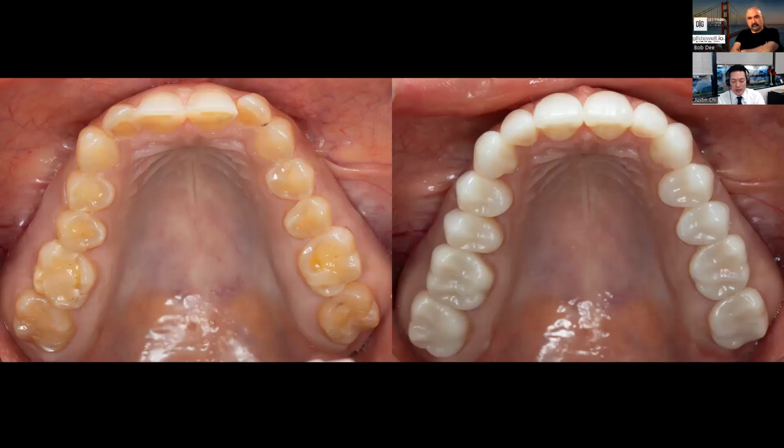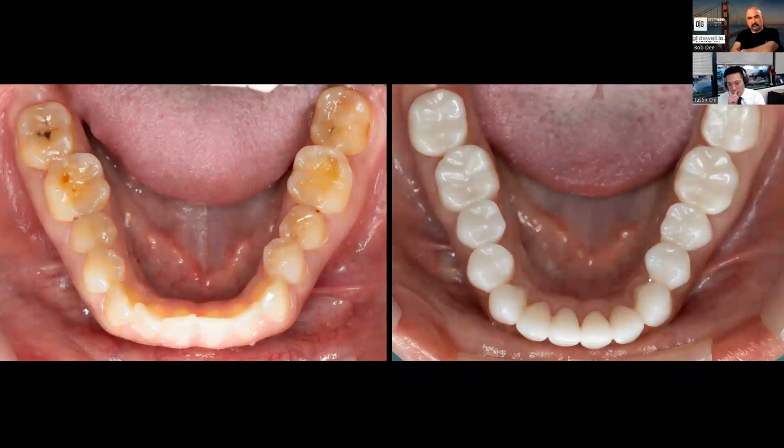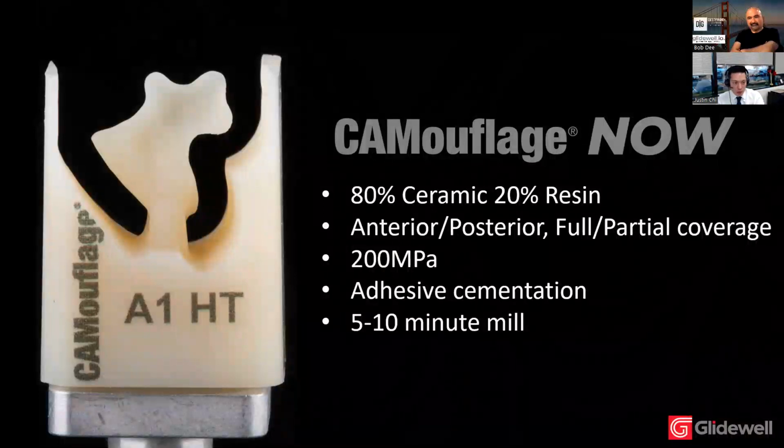And so here's a good look at the before and after on the maxillary, and a look at the lower. And once again, just polish, straight from the mill. No oven was used in the making of these crowns. And so here, just to finish with the patient, always nice to see the transformation. This is fully sintered restorations from the system, full mouth rehab. All right, maybe in the future we can dive into that in more detail.